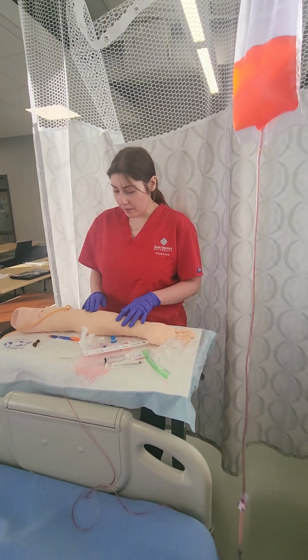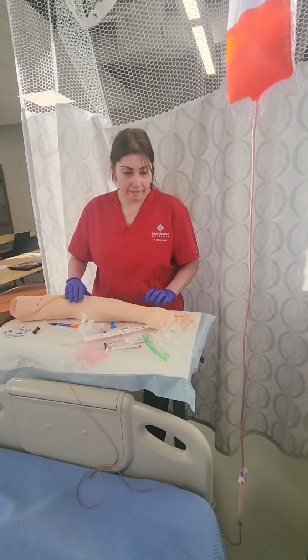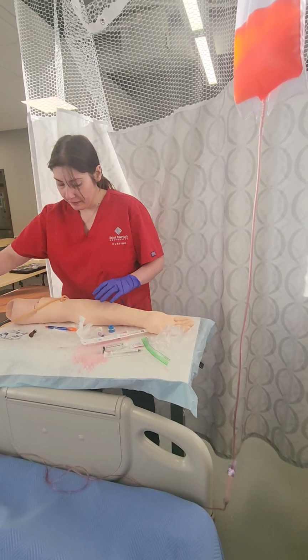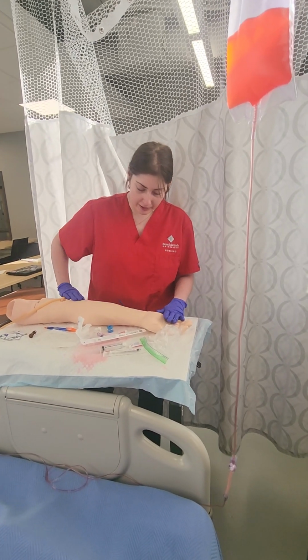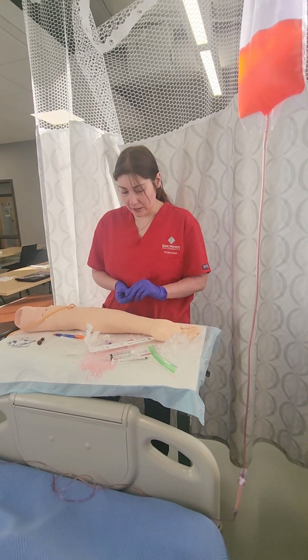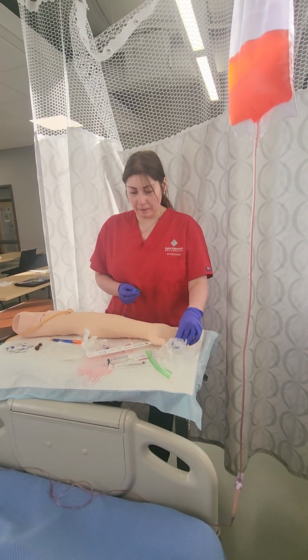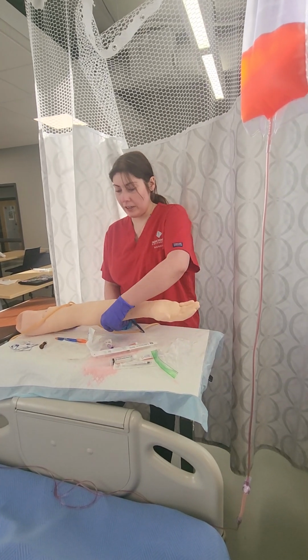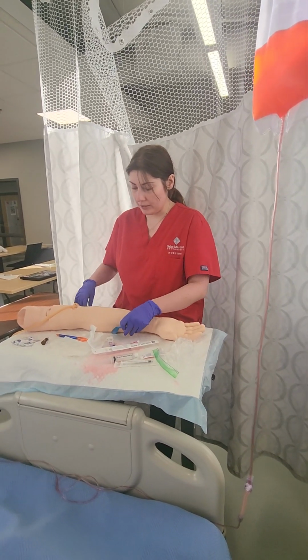Okay, so now I've got my arm here. Oh, it's dripping. Okay, so I got my table over here. I'm just feeling. Okay. Looks like your arm is all ready to go. Okay, so Scott, I'm just going to get this tourniquet on you really tight.